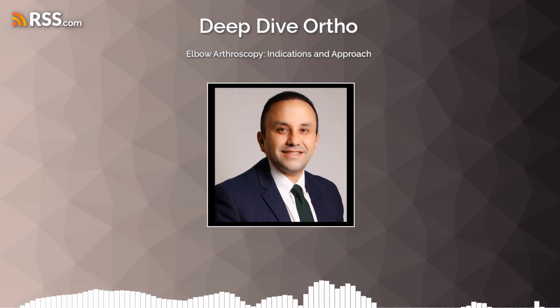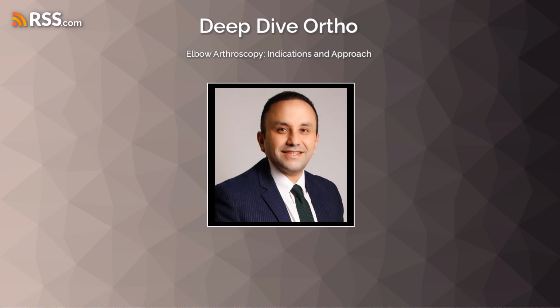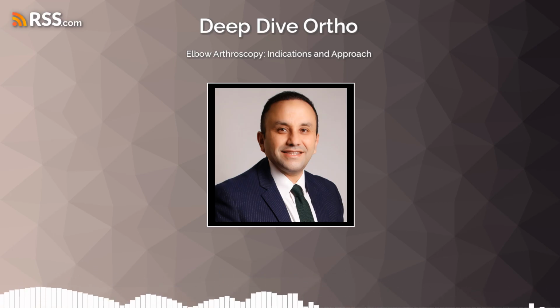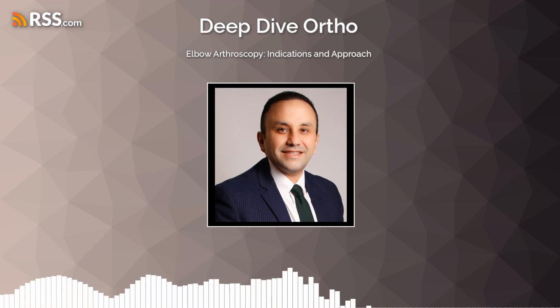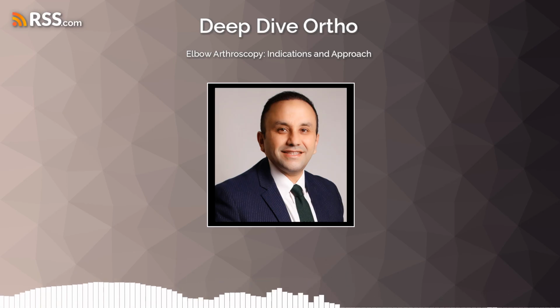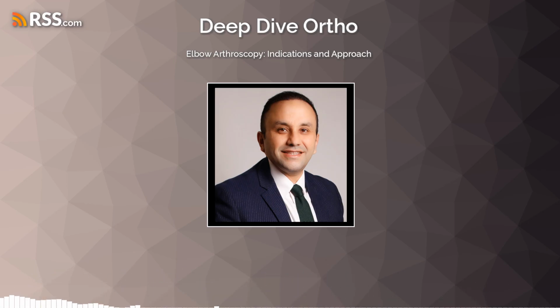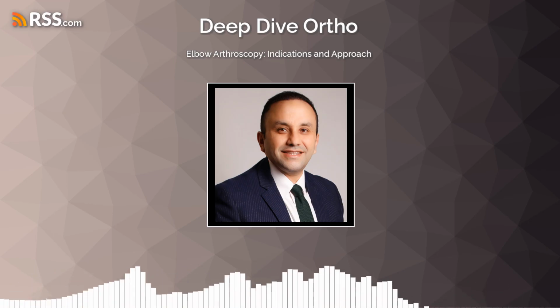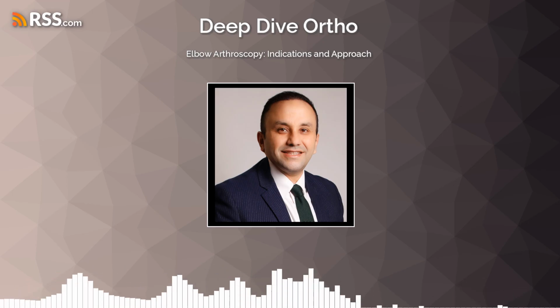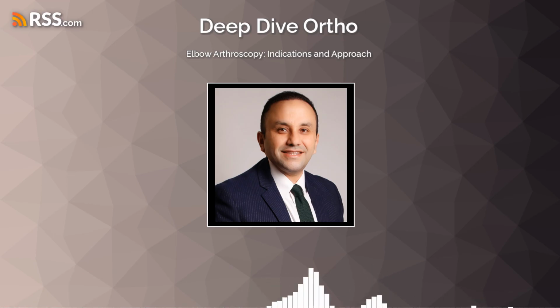The incised deep fascia can be repaired endoscopically, often with barbed sutures, to prevent the nerve from herniating back into its original position. Crucially, we must always check the nerve for any kinking and ensure a proper stable bed is prepared for it in its new anterior position. Post-operatively, the elbow is placed in a sling in flexion for 1 week to stabilize the nerve and facilitate soft tissue healing. That's a significant advancement, moving a nerve endoscopically.